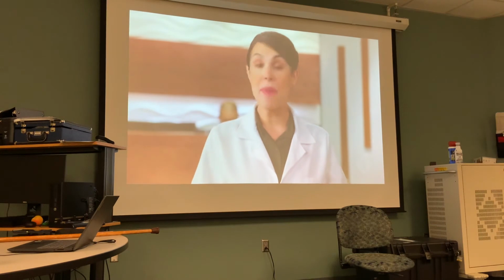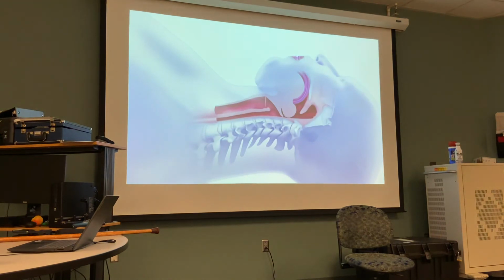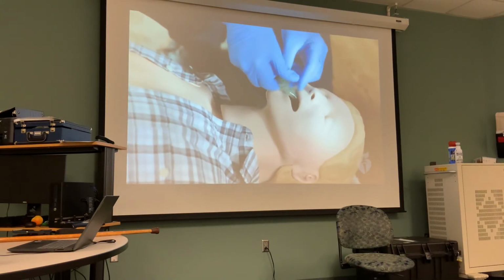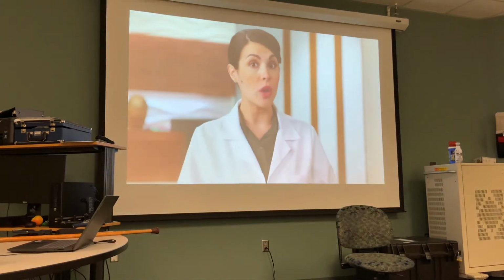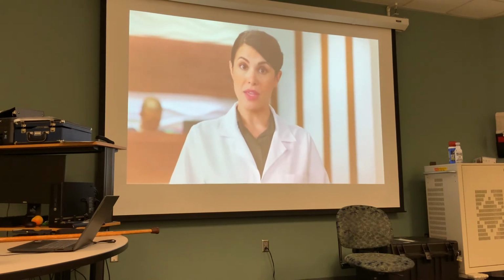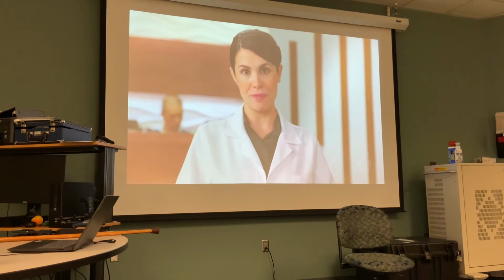OPAs that are too large may obstruct the larynx or cause trauma to the laryngeal structures. OPAs that are too small or inserted improperly may push the base of the tongue posteriorly and obstruct the airway. Healthcare providers should insert the OPA carefully to avoid soft tissue trauma to the lips and tongue. Remember to use OPAs only in unresponsive patients with no cough or gag reflex. If the patient has a cough or gag reflex, the OPA may stimulate vomiting and laryngeal spasm. Only healthcare providers trained in the proper use of an OPA should attempt its insertion.